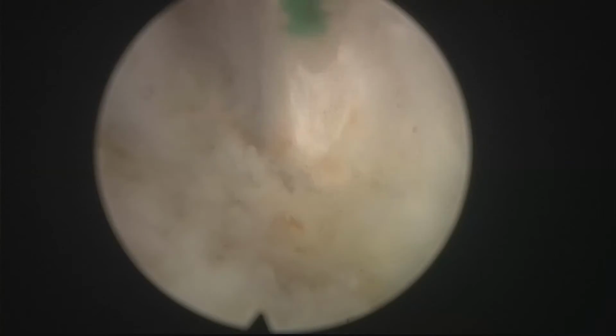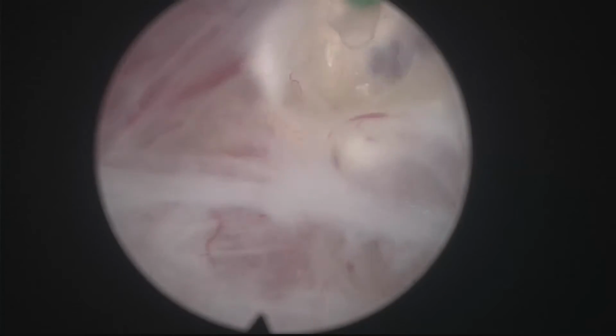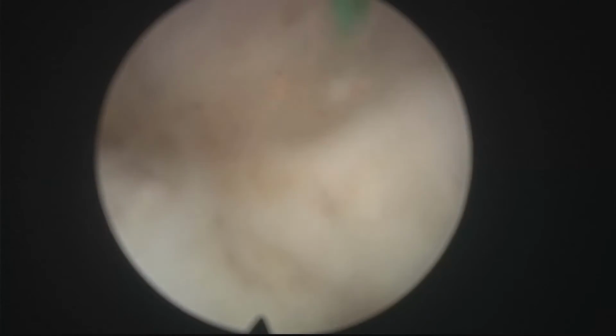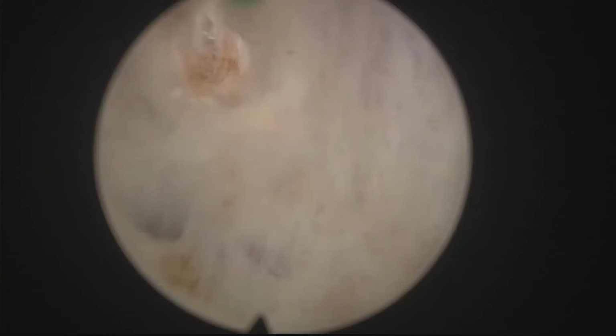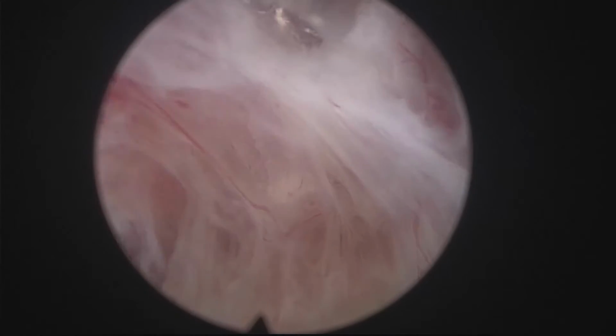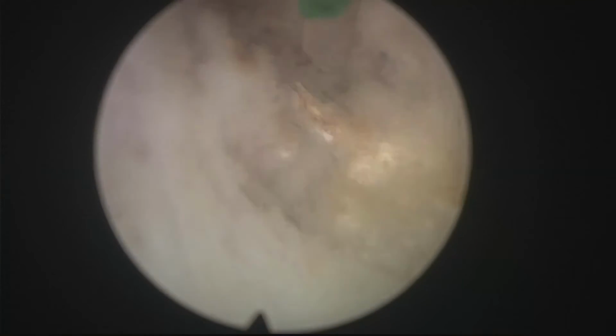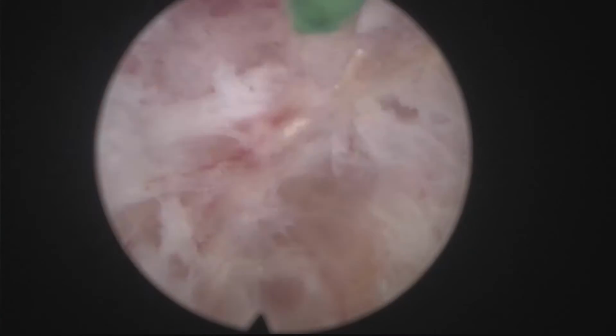You can see here the tissue quality is very strange. The capsule quality is different than usual, and many times we find these dilated spaces, probably obstructed glands after the epithelialization after TURP. So now, of course, the sphincter is totally safe, and I'm just going around trying to follow the plane to see if we can approach the bladder neck progressively.